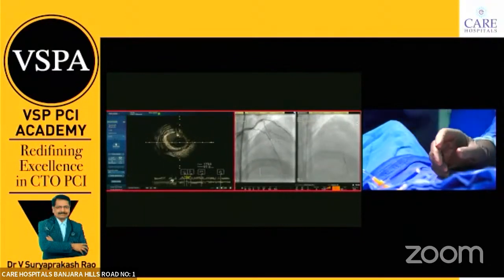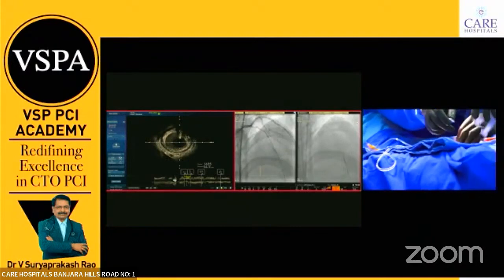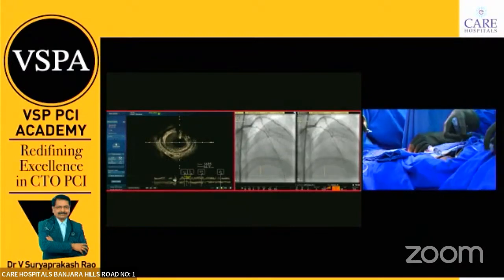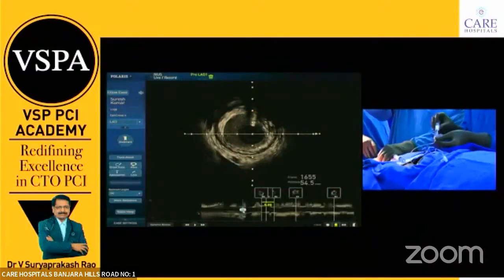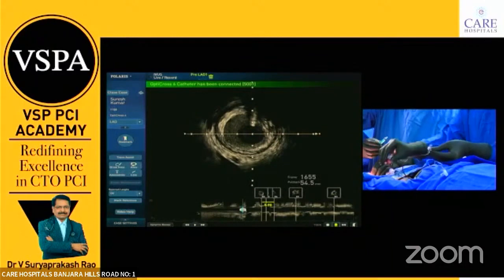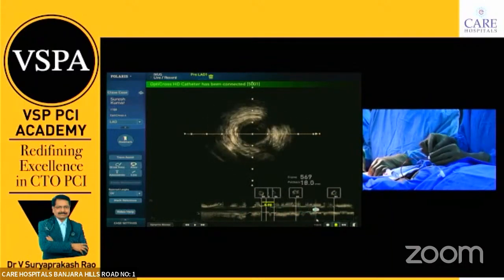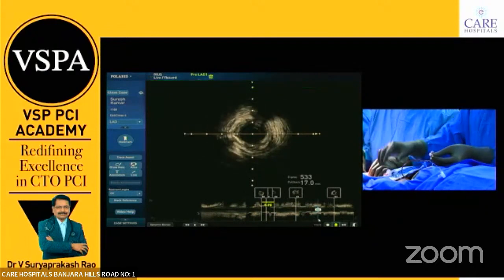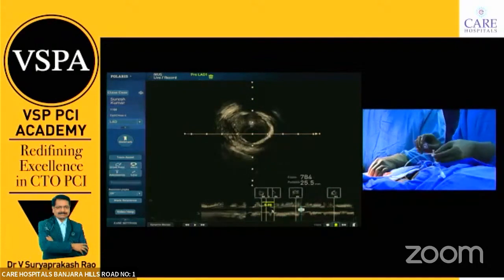I think this portion of the distal LAD is diseased. We need stenting only for the middle and distal segment; in between we need to dilate further, and the proximal one we may need some scoring, some plaque modification.